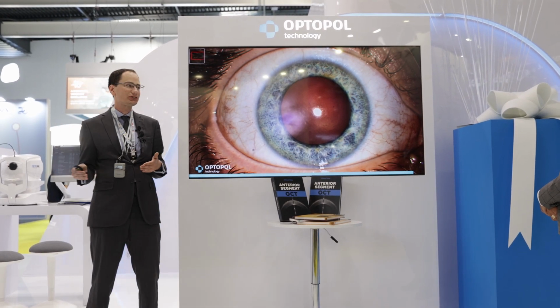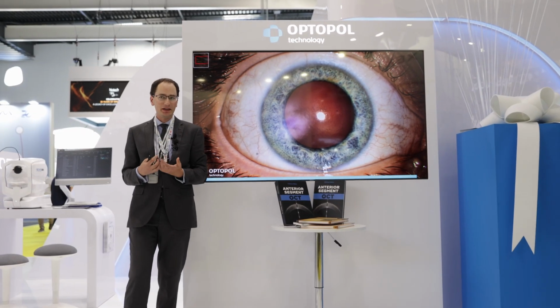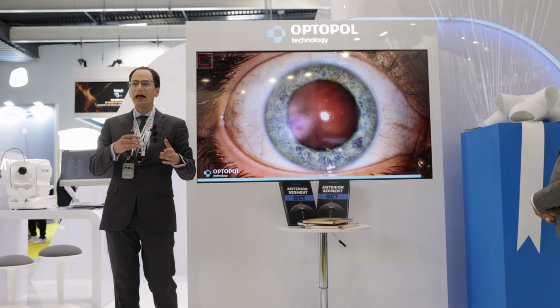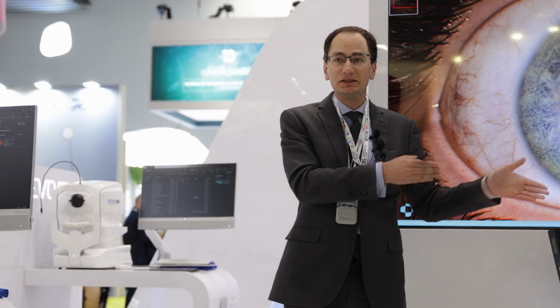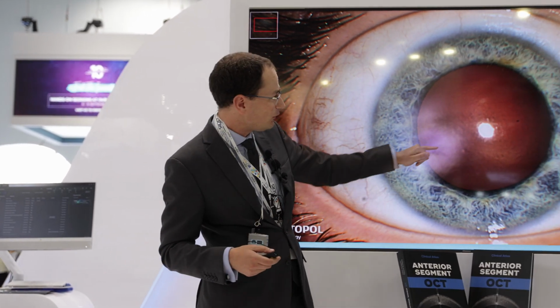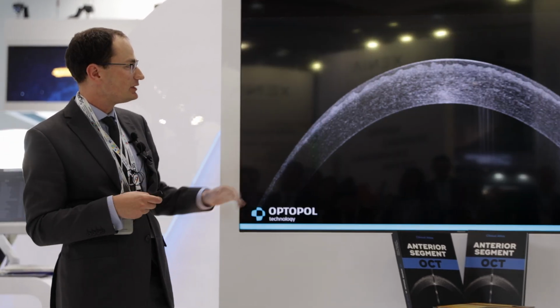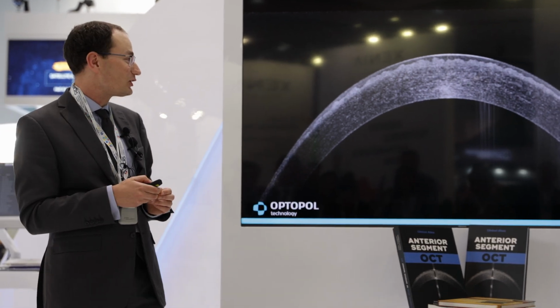I also wanted to show you different stages of dystrophies, because I think this is the biggest drawback of many books: they show you just the typical sign of dystrophy, the typical picture, and they don't really show you the natural course. Let's say Avellino dystrophy looks totally different in a 12-year-old than in a 20-year-old. Also, on the clinical photo of this dystrophy you can see some haze, but if you do the scan, it's very self-explanatory. It actually is on our cover.